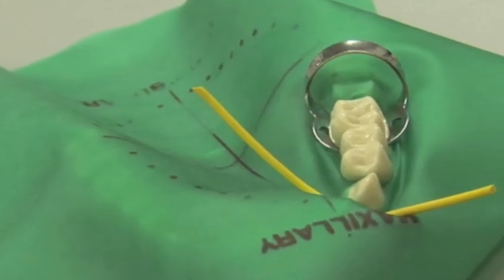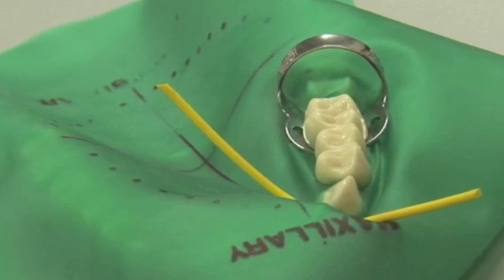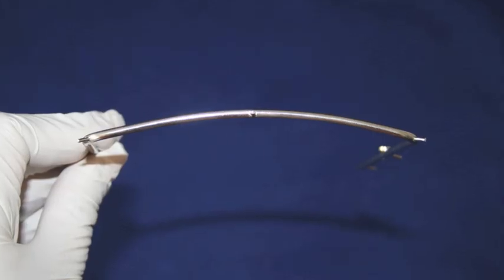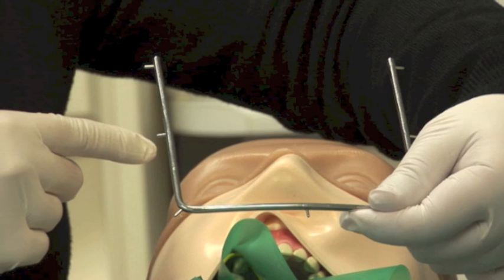Insert the forceps through the holes in the clamp and place the clamp around the tooth. The beaks of the clamp should be on the tooth only — do not place the clamp on the gums.